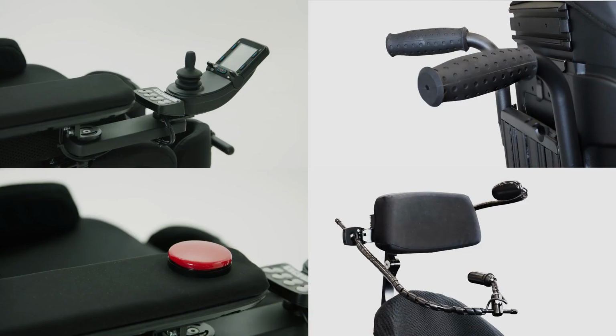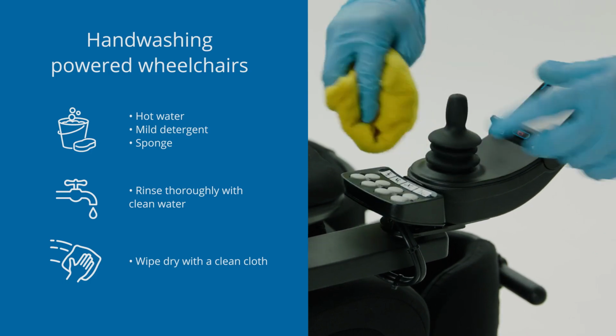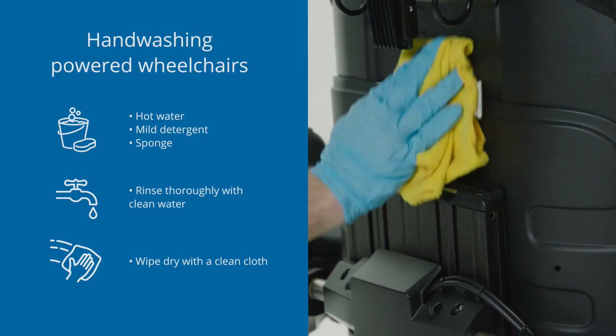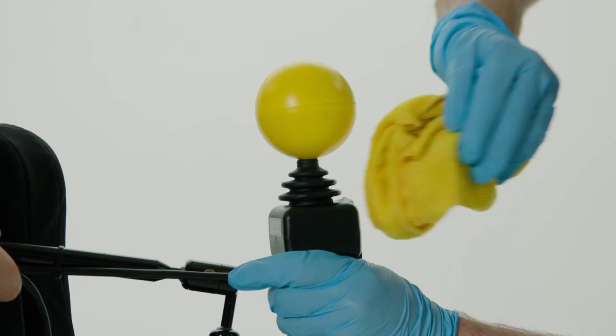The joystick, head and mouth controls, push handles, armrest, and head support should all be cleaned regularly, along with other exposed surfaces, the seating system and chassis. For cleaning metal and plastic surfaces, you should use a soft cloth or sponge dampened with hot water and mild detergent. Make sure to wipe down surfaces carefully. Rinse or wipe with clean water and a soft cloth, and let completely dry before next use.